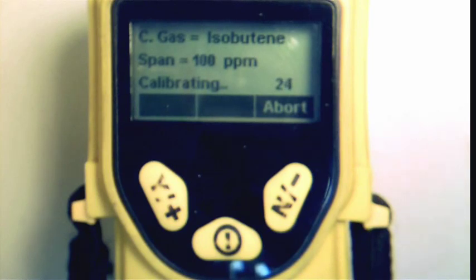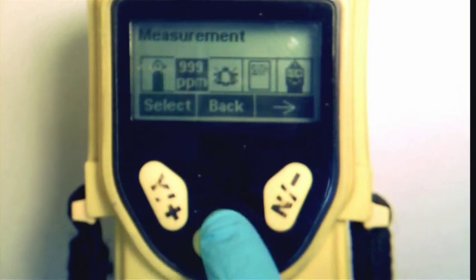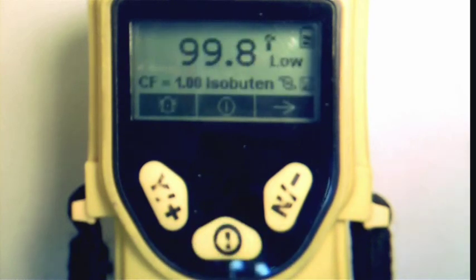Once the span calibration is complete, the display will confirm the calibrated reading. At this point, we recommend that you keep the bag connected and perform a functional bump test. The test will ensure that the calibration was successful. Press the middle button once, and then press the middle button again to go to the main display. You should notice that the unit is reading a concentration of 100 ppm, or at least within 5% of 100 ppm.